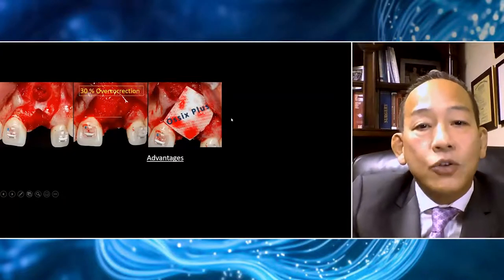The second decision is membrane selection. GBR is technically sensitive because graft can migrate and coordinating the graft while holding and tacking the membrane can be challenging. This is where membrane selection is extremely critical. I am using Ossix Plus. Once I place my graft, I wet the membrane and lay it passively over the graft material to isolate it from the flap. Because of the membrane's ease of handling, it lays down without requiring tacks or sutures. I have never had to tack this membrane down in close to 20 years of use — a huge advantage that simplifies surgery.